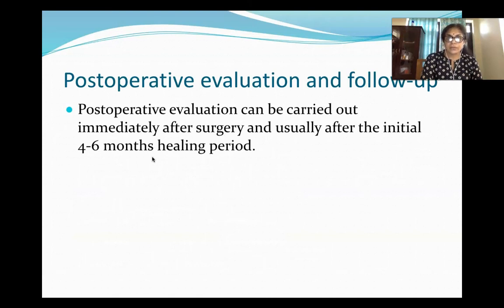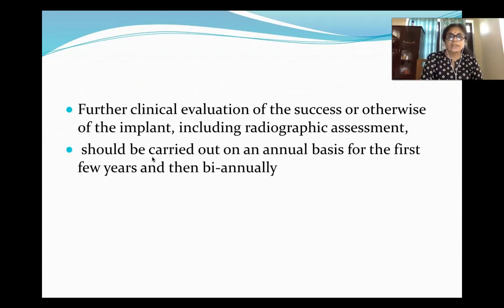Post-operative evaluation and follow-up is also done. Post-operative evaluation can be carried out immediately after the surgery and after the initial 4 to 6 months, which is the healing period. In that also, evaluation is to be done. Later on, we can clinically evaluate the success or otherwise of the implant, including radiographic assessment. It should be carried out on an annual basis for the first few years and then biannually.